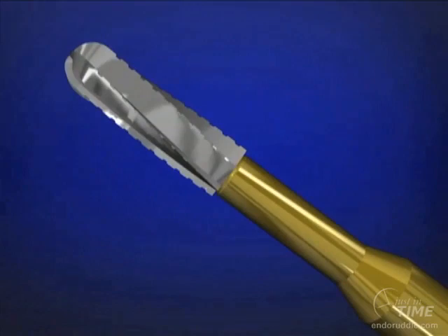Well, a transmetal burr is a useful burr because it removes a lot of the unwanted vibration. When you're making an access cavity through amalgam or through a precious and non-precious metal casting, oftentimes there's vibration, especially when there's a hot tooth. These vibrations can mean the patient will complain that they're not profoundly anesthetized. So even though you might need to give an intraligamentary injection or a Stabident or some kind of an auxiliary injection to your block anesthesia, one of the ways to manage discomfort is to use a sharp sawtooth type cutting blade where we can reduce the unwanted vibrations.